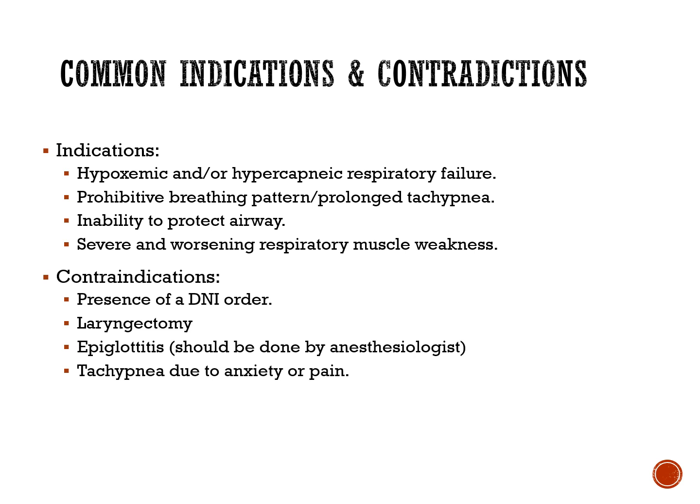And the last thing you want to do is have a less experienced intubator there, visualizing a glottis that's much smaller than what you would expect, and perhaps causing a laryngospasm. That could cause that glottis to totally spaz. Now you don't have an airway opening at all, and now you have a true medical emergency.